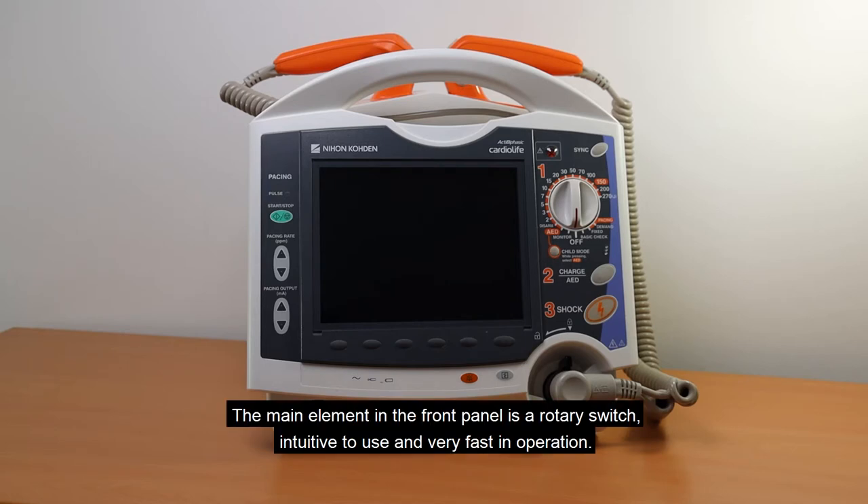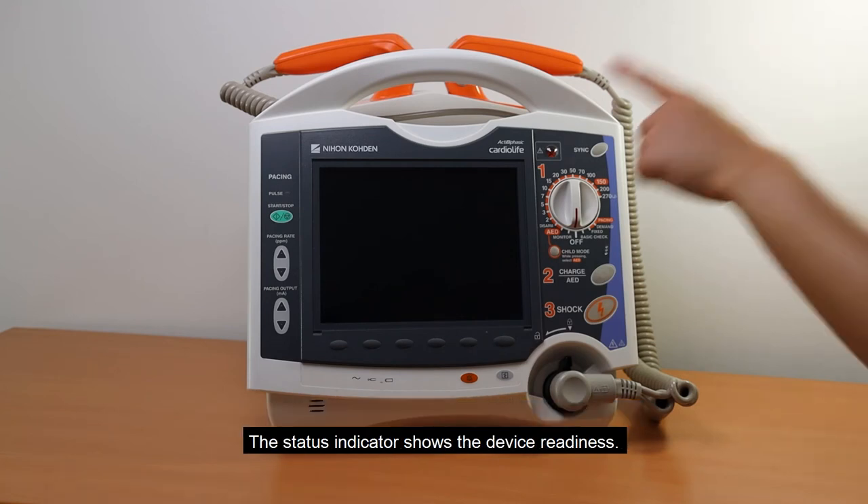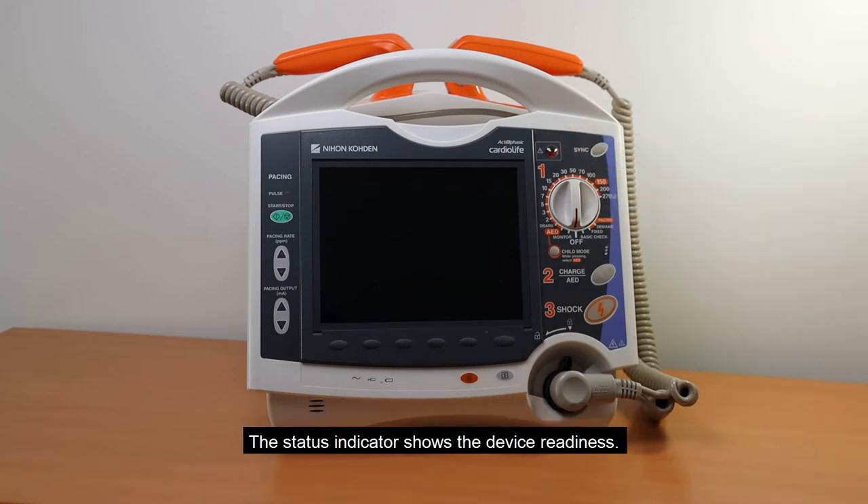The main element in the front panel is a rotary switch, intuitive to use and very fast in operation. The status indicator shows the device readiness.